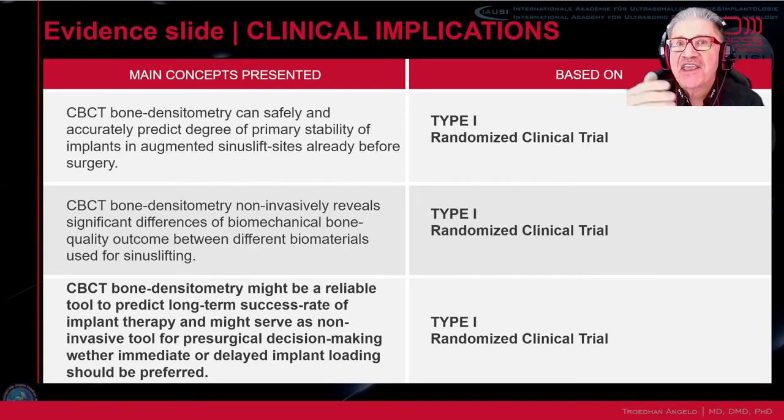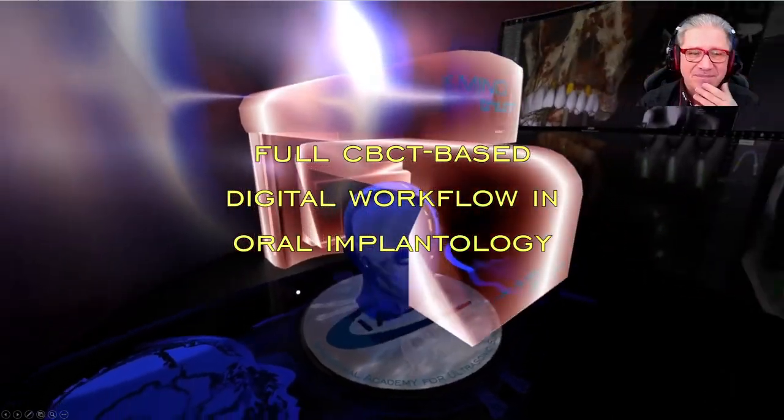It's not just hearsay, because then the patient will say, yeah, but Dr. Google says. In this case, you can say, no, I know the bone quality in this area where we want to insert implants is not good enough for immediate loading. You will lose the implant, you will have pain, you will have high cost, and the bone is lost. We cannot place a new implant at this site.